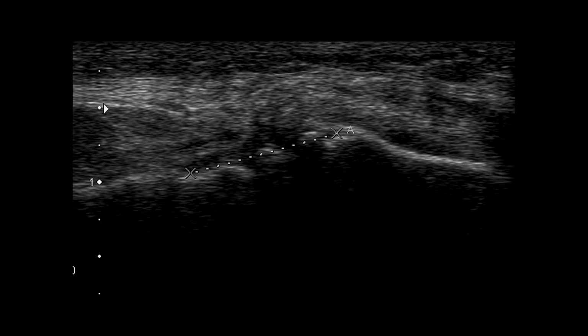The transverse projection provides additional diagnostic clarity. At the tibial insertion, the ligament demonstrates focal reduction of echogenicity within the enthesis. The normal, well-defined cross-sectional architecture appears partially blurred with loss of the typical organized fibrillar pattern.